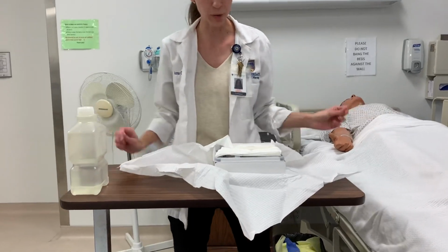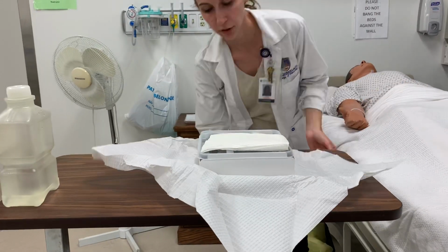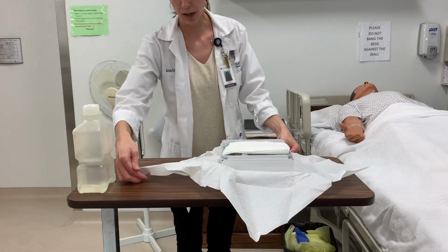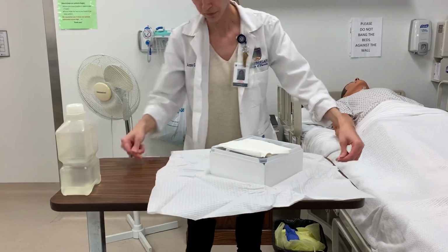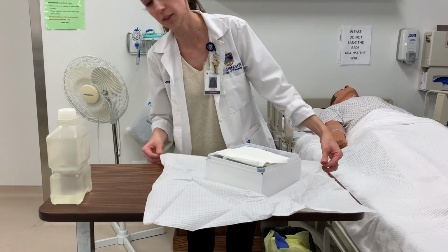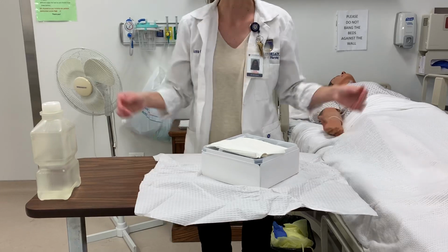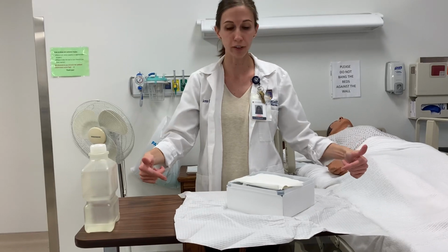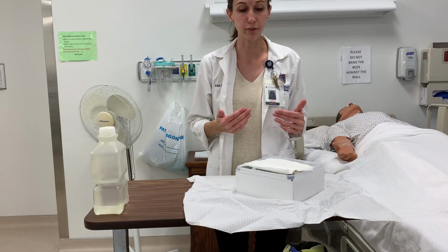And I can only touch that 1-inch border, or 2.5 centimeters. I'm going to grab this one and open it. Again, I wouldn't want this to touch my clothes at all. I can now grab just the border, making sure that my kit doesn't become contaminated. If this flopped over like this, I could obviously change out my kit because I broke sterility. So again, I can only work with non-sterile hands. I can only touch the 1-inch border, or 2.5 centimeters. At this point, I would have to be conscious not to cross over my sterile field in any way.